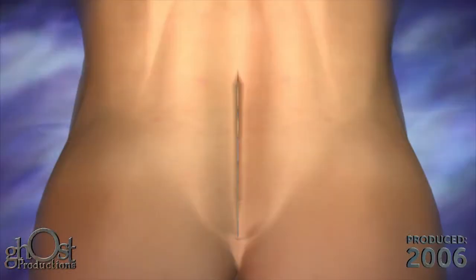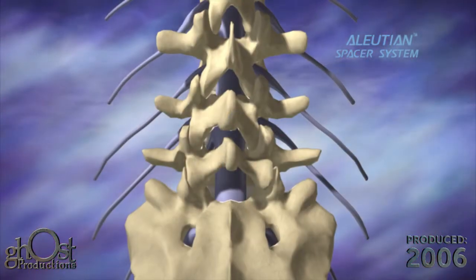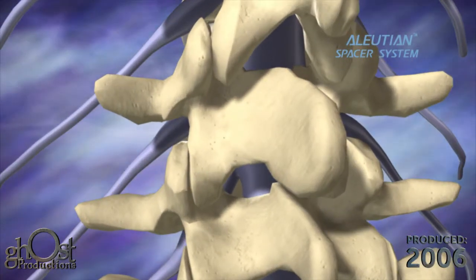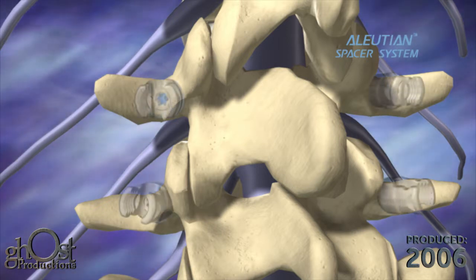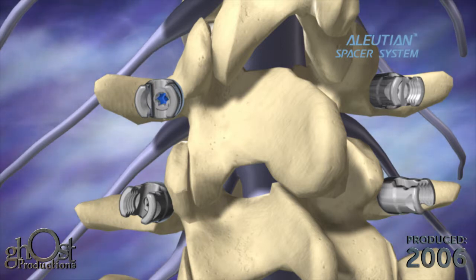The patient should be positioned as appropriate for a posterior approach, taking care to preserve or improve sagittal alignment of the spine. After the pedicle pathway has been prepared and proper pedicle screw length and diameter have been determined, the appropriate implant is selected and loaded for screw insertion using the threaded screw inserter.